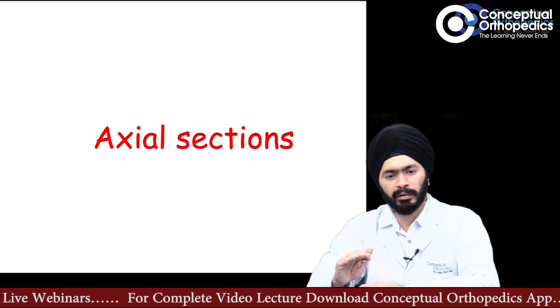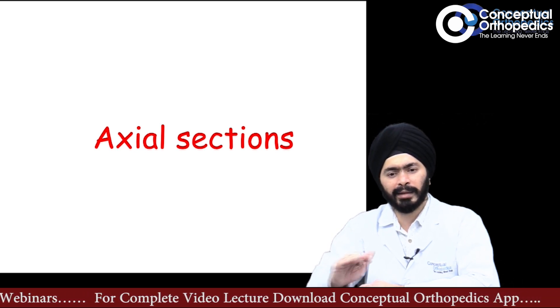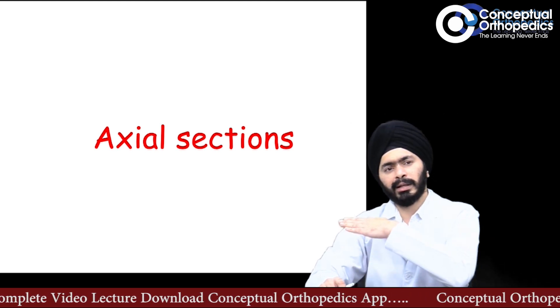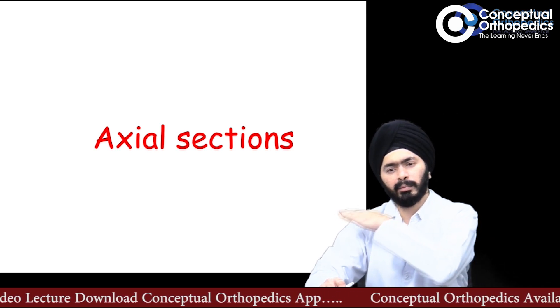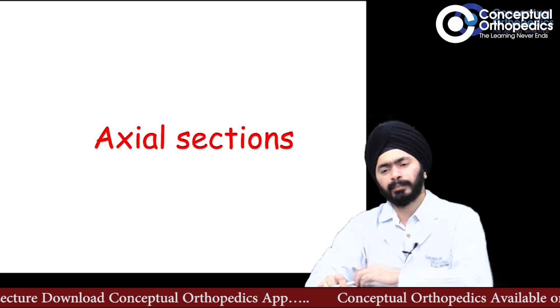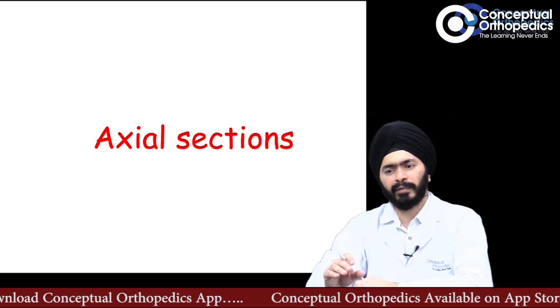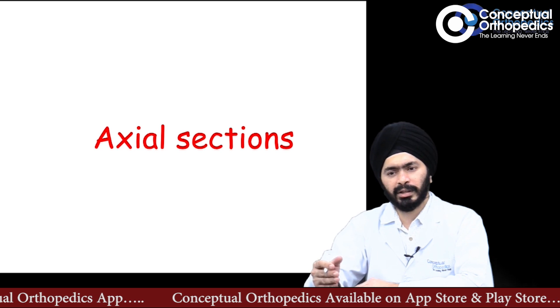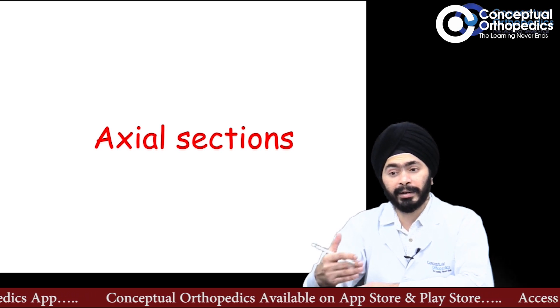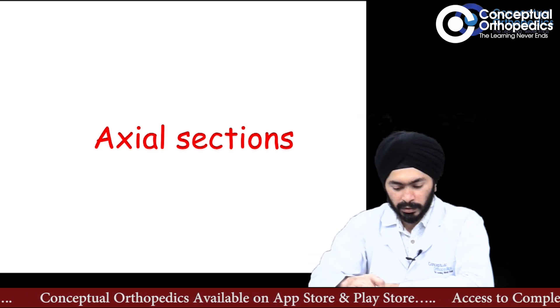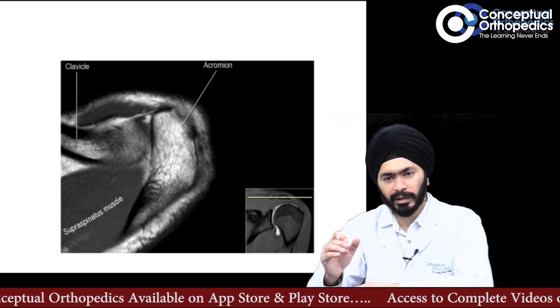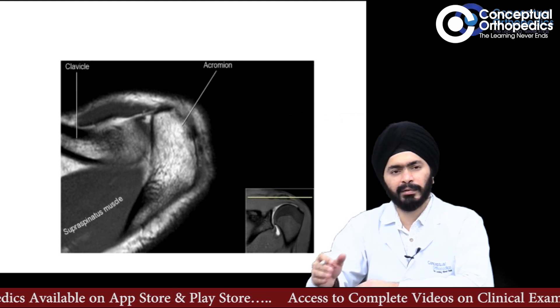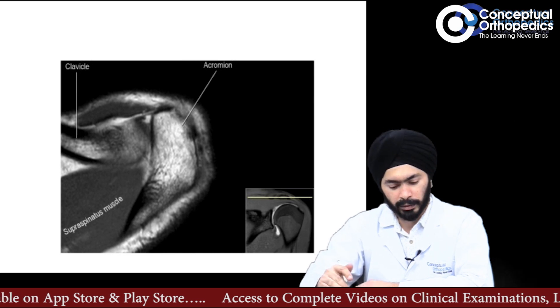First, let's talk about how axial sections look and what you are looking at. Axial images usually start from top to bottom. What will help you identify whether these are upper or lower sections is: if you see the acromion, the AC joint, and the clavicle in the first section, you are going from top to bottom.